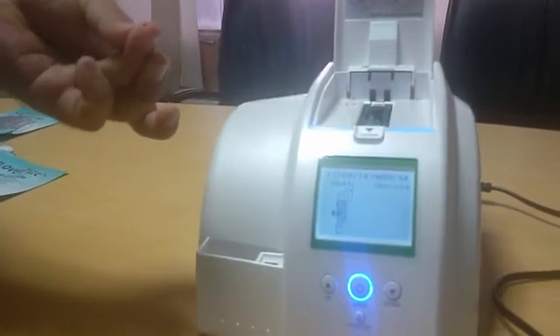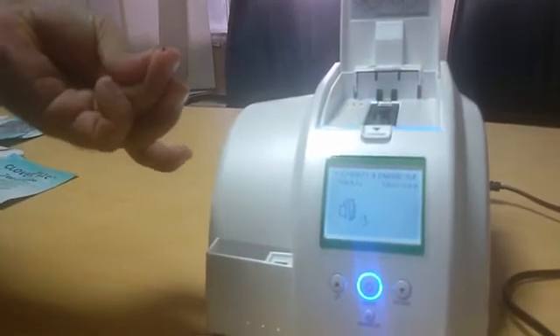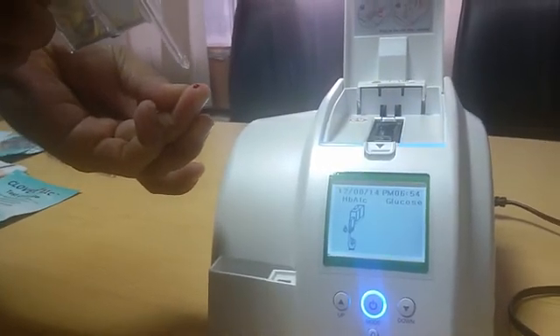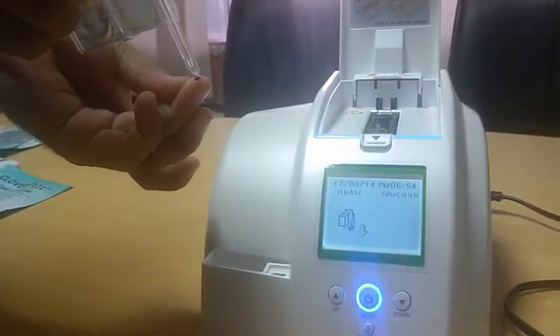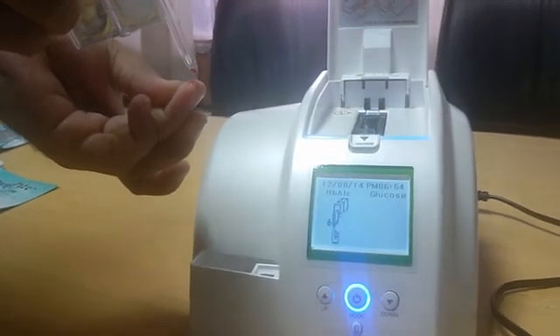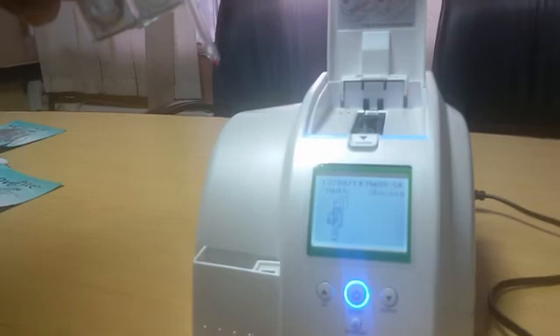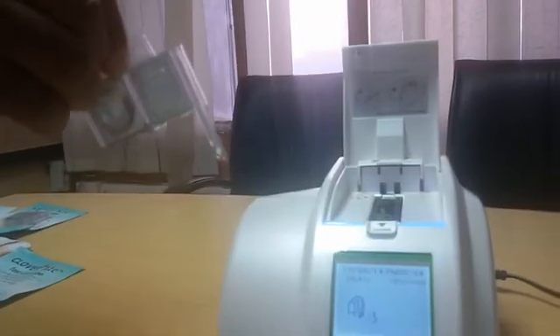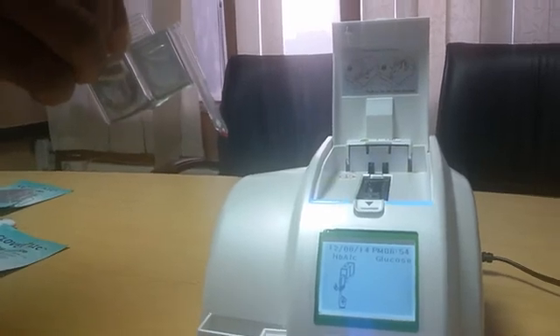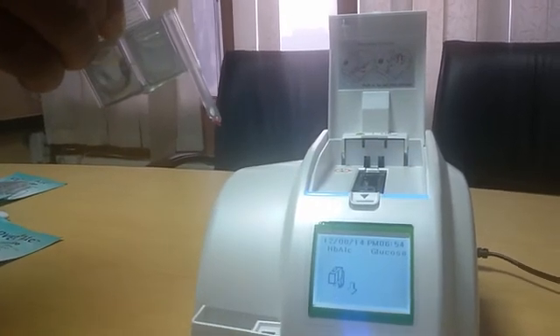Aspirate the second drop into the reagent pack. You must hold the reagent pack at a 90-degree angle to the finger. Please ensure that the tip of the capillary just touches the drop of blood — the tip should not be immersed into the drop.